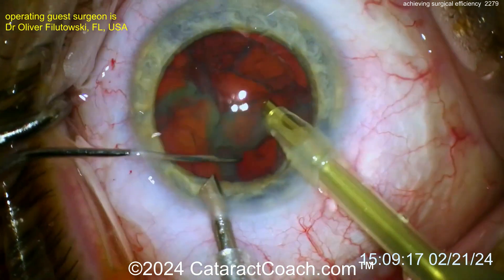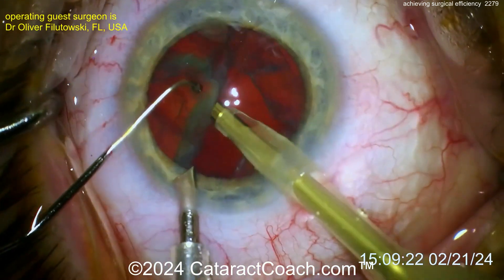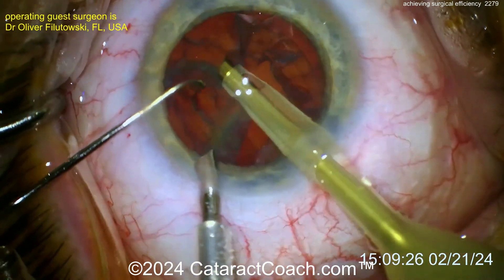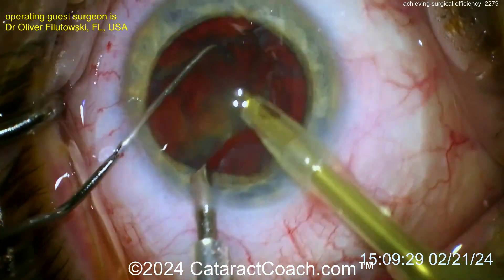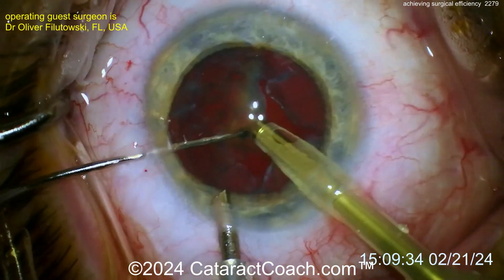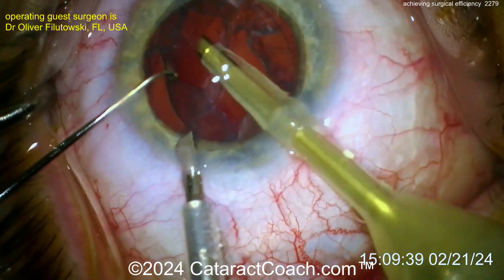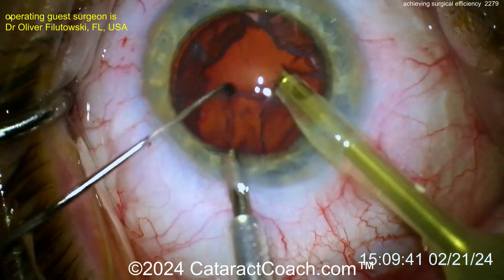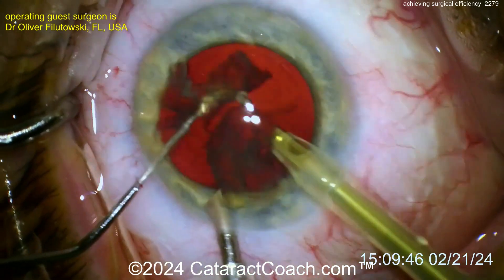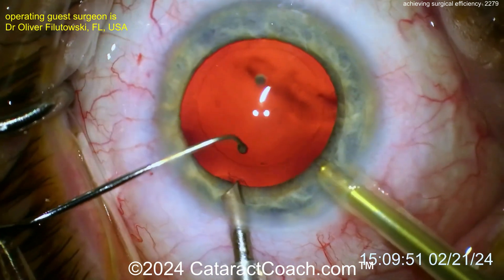At this point your scrub tech is probably already loading up your lens to make it even more efficient, and getting the next patient ready. Half the nucleus is already out, here comes the other pieces. Bare amount of phaco energy. What about no viscoelastic? Well, it's the surgeon's preference. I think viscoelastic has some good protective properties over the corneal endothelium and helps maintain space in the eye. But in this situation, there's a very minimal amount of phaco energy just using that chop technique — so these patients can still have a very clean cornea the next morning.